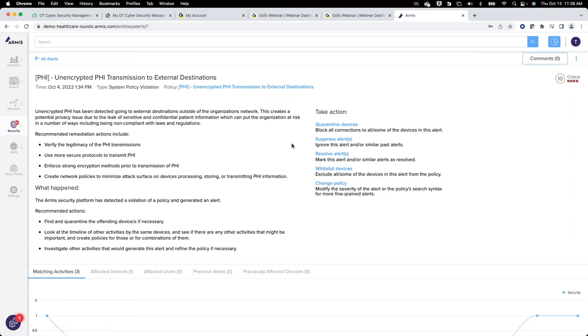So you showed an extraction of a piece of equipment, where you showed all the operating system, all of it. How do you gather that data? Through traffic. The traffic and different data sources that we're pulling from. So now the different data sources are going to be integrations that we have, but that's going to be more on the traditional, you know, IT side. But for medical devices, you don't have agents on it. We can't pull from that. So it's going to be through the traffic that we're monitoring.